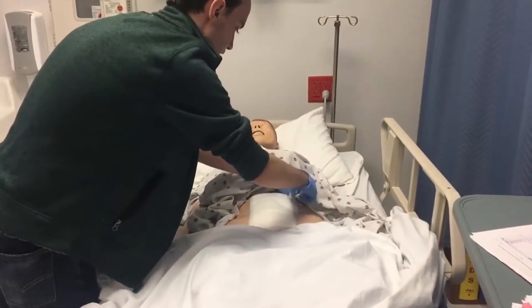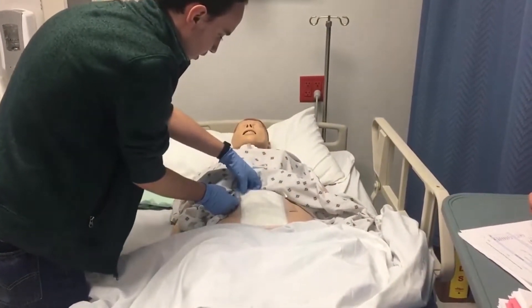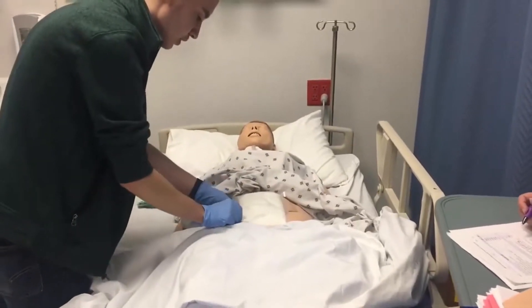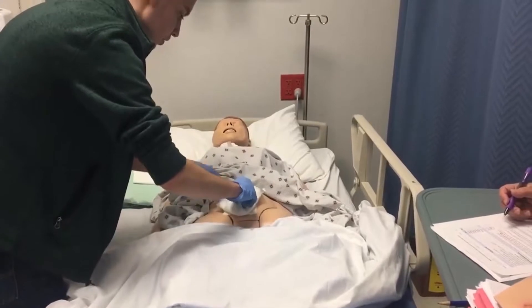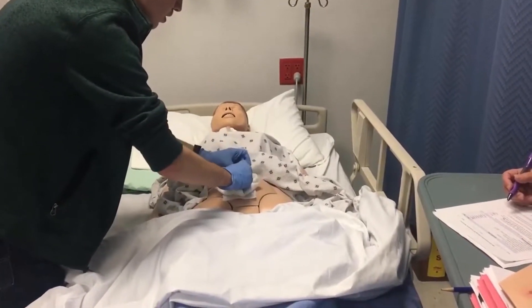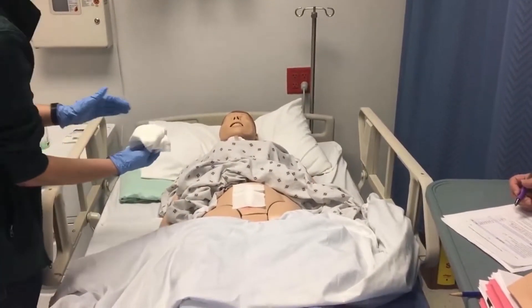Making sure that I remove it so it's not being ripped. I do not see any discharge on it here because it's clear.